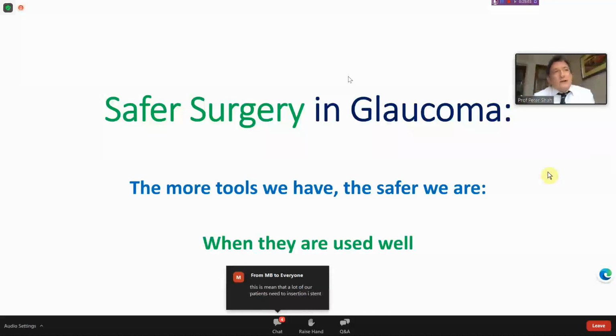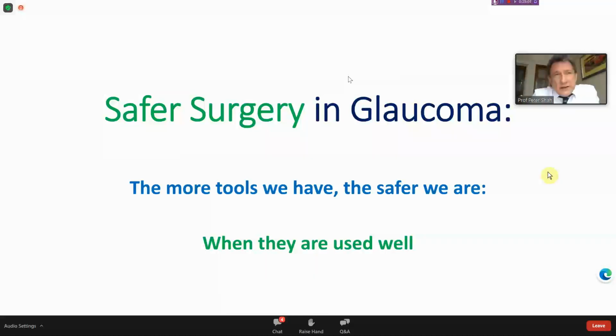That's another really good question. And the way I'd answer that, Imran, is before I started doing SLT, and I've probably been doing SLT for about 14 years now because I was an early adopter, I'd probably done another 12 years of ALT. I'd got to the stage where I'd done so much ALT that I was experimenting with power settings. Towards the end of the ALT era, we were using ultra low power ALT to see if we could get the same results. I have to say, high power ALT, I do think caused angle fibrosis in some cases. And you'd even get little peripheral anterior synechia sometimes. I do think it made the angle more brittle because I think it was more destructive. So that was my own personal experience.